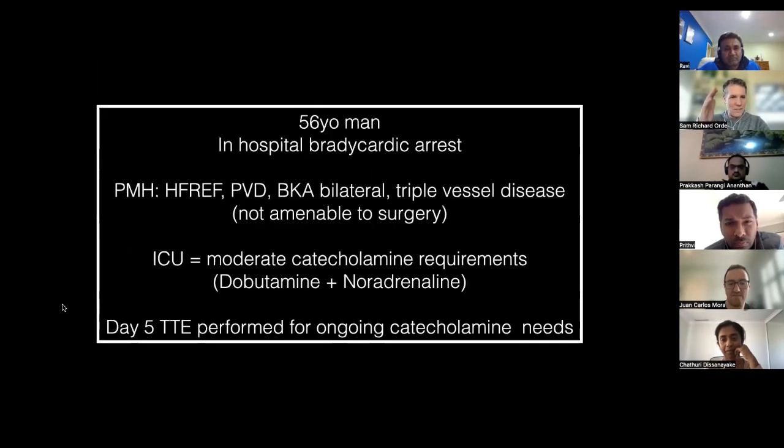I think my only comment is, I think you said everything right there. That was a solid pass for me, and I think what might be worth doing, as we've done a couple of times in previous sessions, is: if I showed you this, what am I going to ask? If you're reading through this stem, you can see this horrible vascular patient with a history of heart failure. We're going to be looking at poor LVs, in-hospital bradycardic arrests. What's the cause for that? Ischemia, PEs, I don't know what we're going to show.